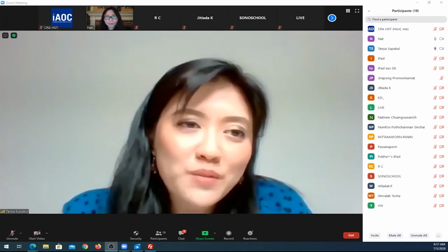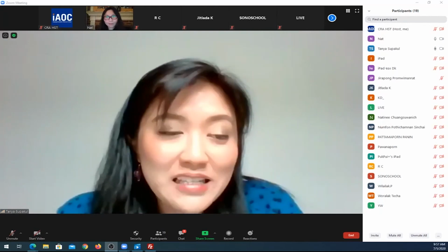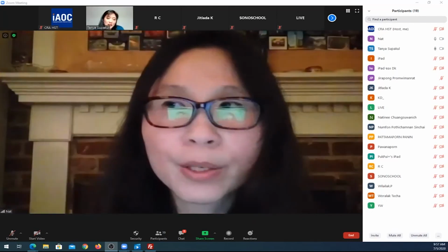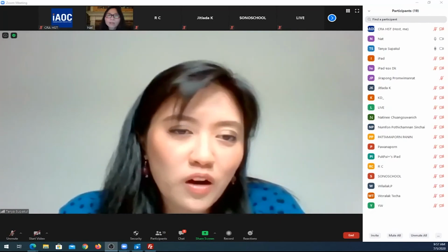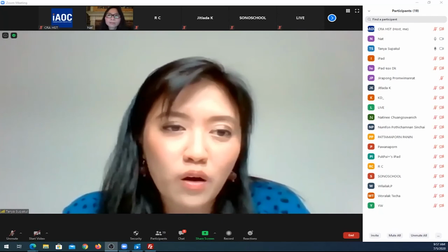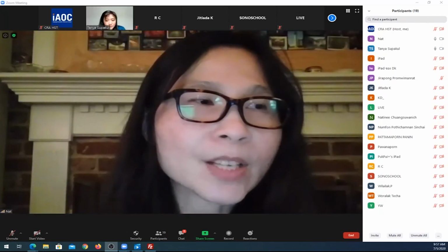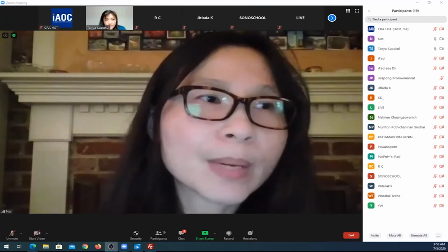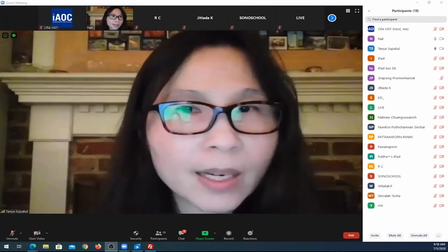So what information should technologists know before scanning the patient? Because in Thailand sometimes they don't have the radiologist sitting next to them. What is the basic 101 knowledge they should know before, or when they should call? Some technologists are really experienced, but some are not. So they should have checklists like we do, because we have to prep the patient. We have to give them a beta blocker. We have to give them nitroglycerin.